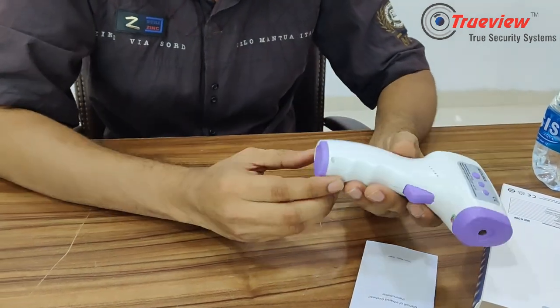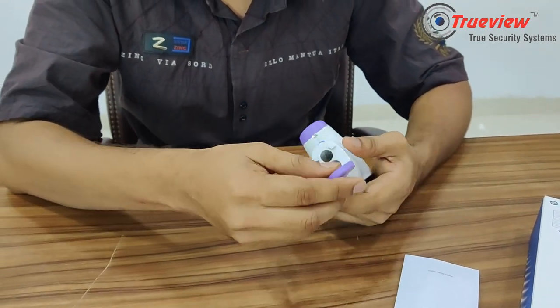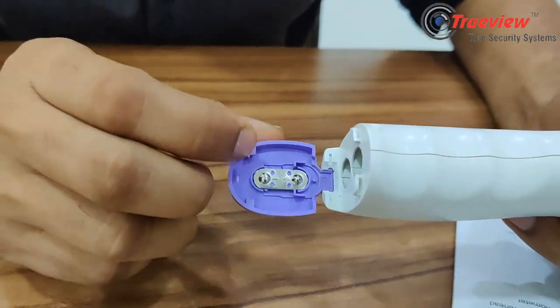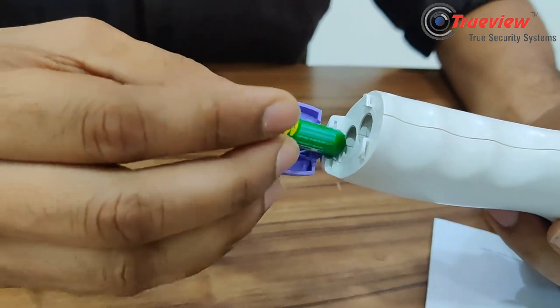Let me show you the battery. If you want to insert a battery, you open the battery compartment. You can add the battery noting the plus and minus orientation, so you have to insert it correctly into the compartment, making sure the plus side is aligned.